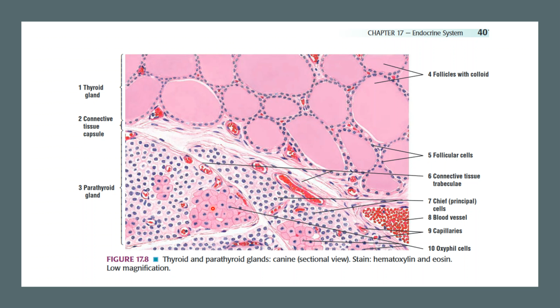In between, here and there, we are able to make out another group of cells. They are called oxyphil cells. These are all the oxyphil cells. If you compare the oxyphil cells and your principal or chief cells, the staining character is different. Chief cells are light stained with eosin. One cell is roughly polygonal in shape with a central nucleus, and it is light stained with eosin.